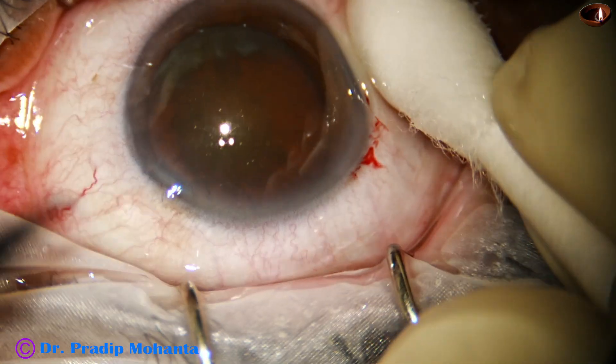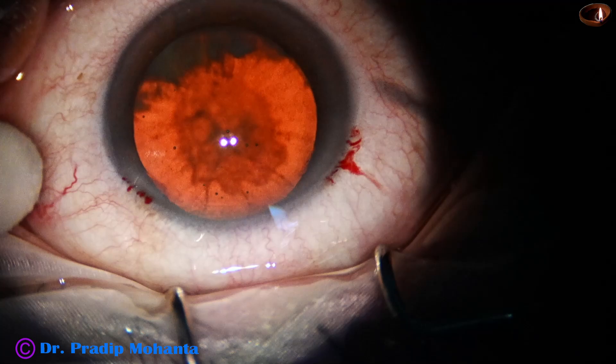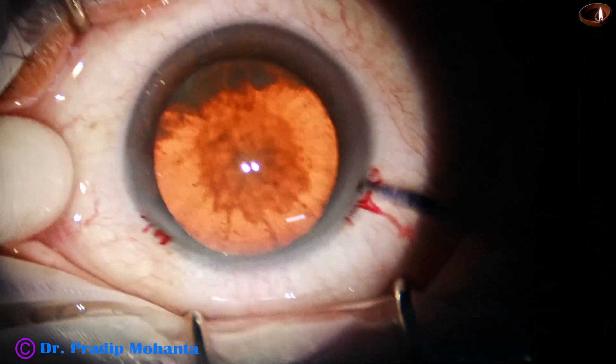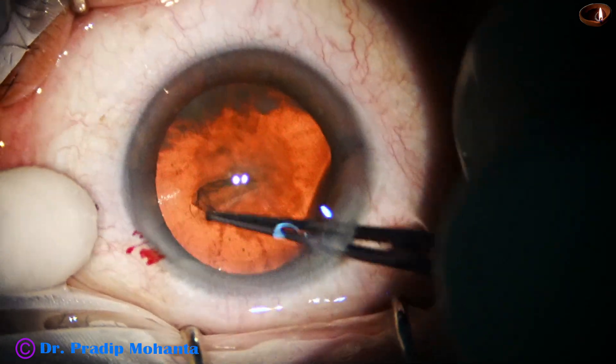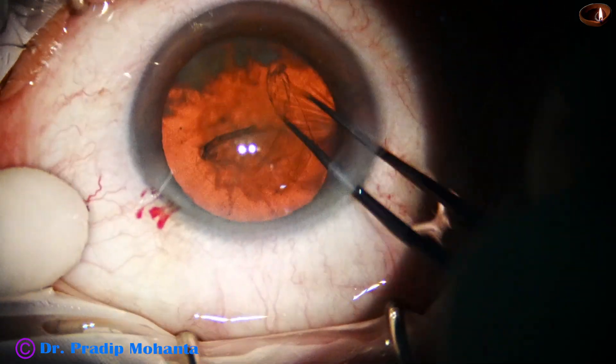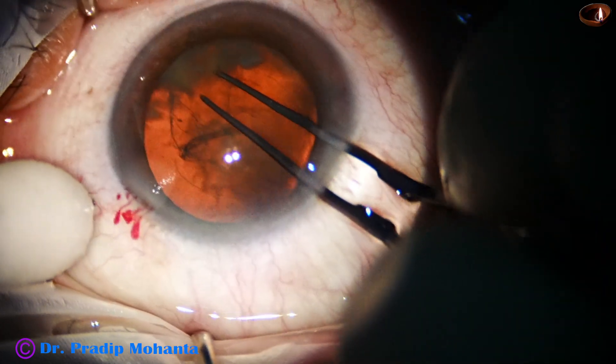A side port is made on the left side of the main incision, about 3 clock hours away. Now, capsulorhexis. This is a Lumera T microscope with a beautiful red glow, and the cataract appears soft with such good red reflex.